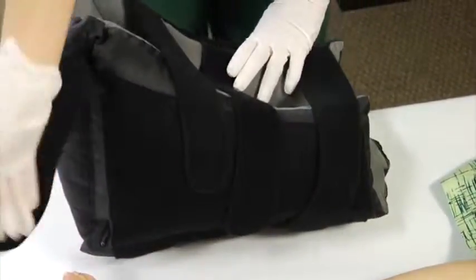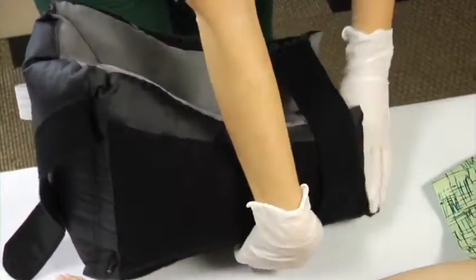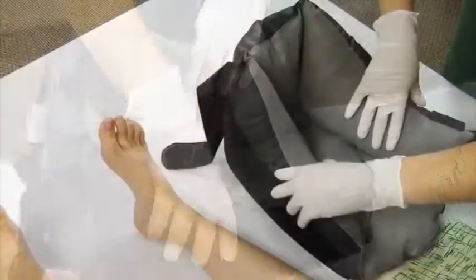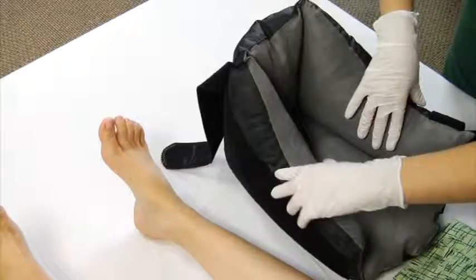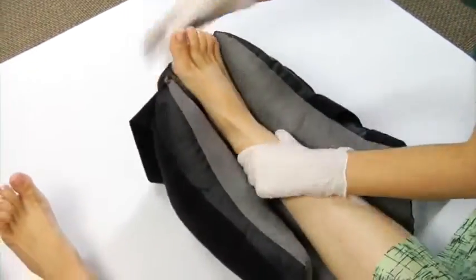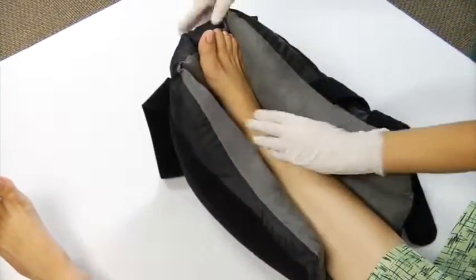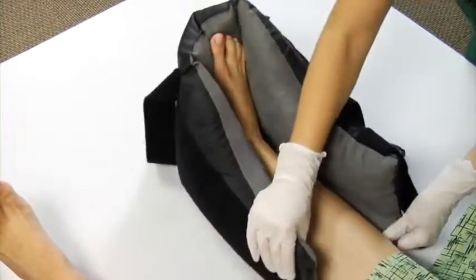Start by unfastening the straps. Make a mental note of how they look because they will go back the same way when the boot is placed on your patient. Place the heelmedix on the bed with the long side of the boot beside your patient's leg and the boot opening facing up. Carefully place your patient's foot into the boot with the lower leg on the long side of the boot and the heel above the opening. This positioning will help ensure that the heel is offloaded.